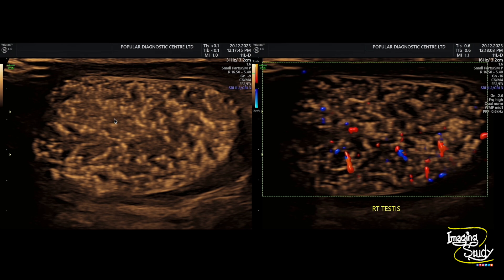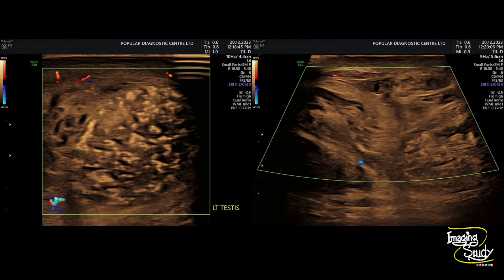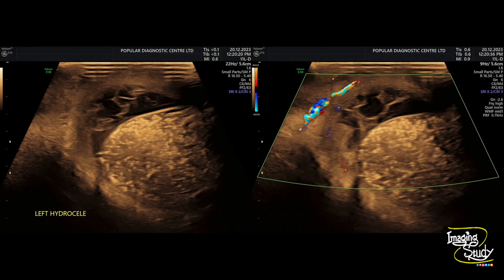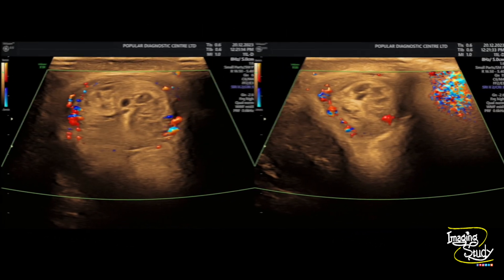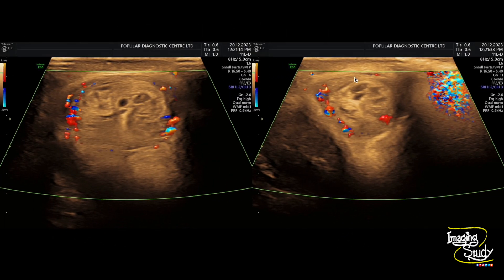This is the right testis with microlithiasis, and on color Doppler you can see vascularity within normal limits. With the same settings on the left, you can't see any vascularity within the testis or the visualized part of the epididymis, though vascularity is seen within the thickened scrotal skin. This is the left-sided hydrocele with internal septations indicating hemorrhagic or inflammatory contents. The lamellated mass cephalad to the left testis indicates coiled spermatic cord components forming the whirlpool sign with twisting or whirling on color Doppler.